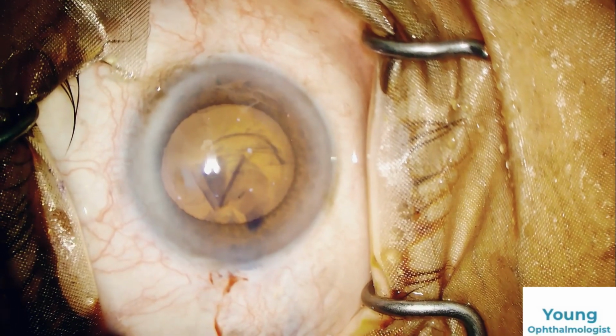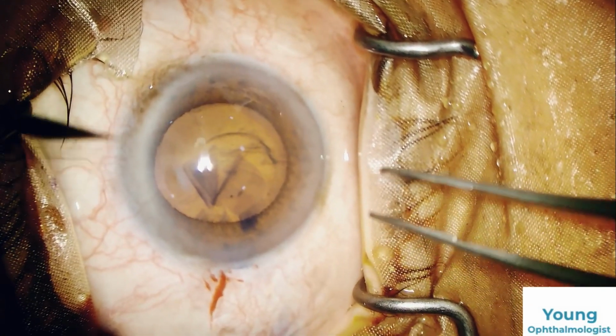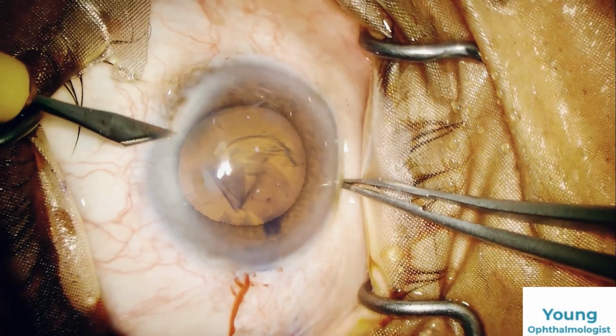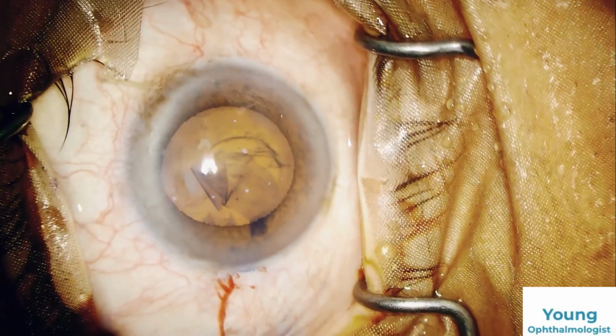If you have a bigger capsulorhexis, it's easy to prolapse the nucleus and do phaco, because sometimes it's difficult to get a crack in these soft cataracts. Here we have a grade 2 cataract, making a side port 4 clock hours away from the main port.